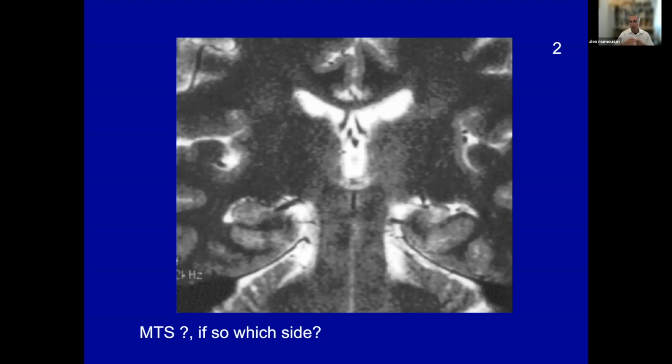Again, depending on your scan, although I have to say I've seen a number of scans that have been provided to me from Armenia, and I'm very impressed with the image quality I've seen. So obviously you have access to good quality imaging, and you should at your hospital either have, or be developing, dedicated protocols to visualize the temporal lobes. And again, you want to be oriented perpendicular to the long axis of the hippocampus. You want to have your slice thickness on the order of not necessarily 1 millimeter, but I think probably 5 millimeters or less would be the ideal.